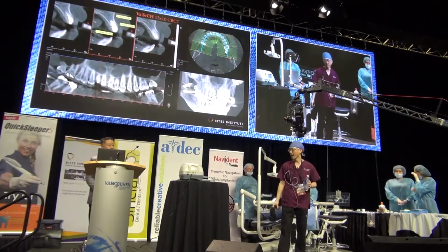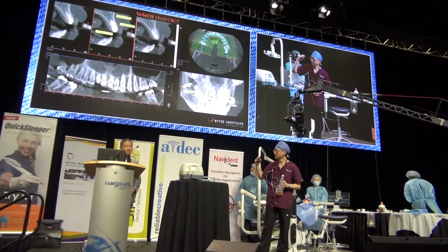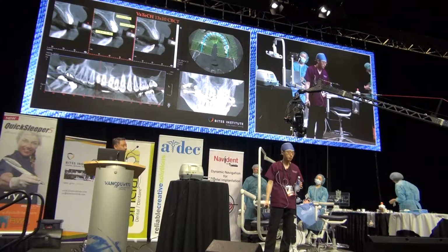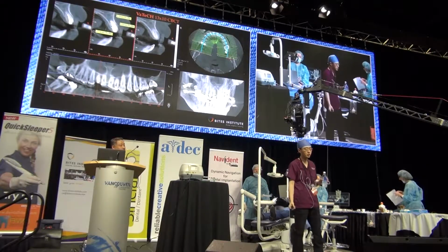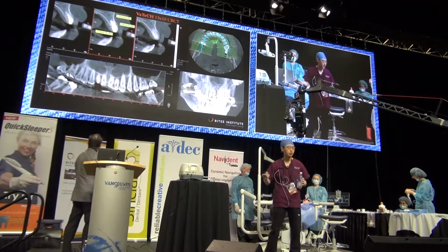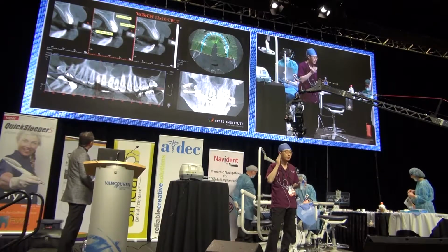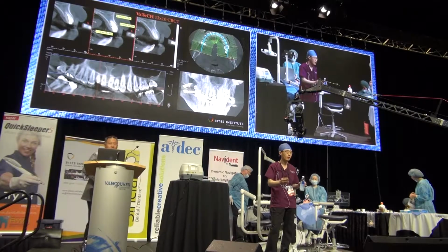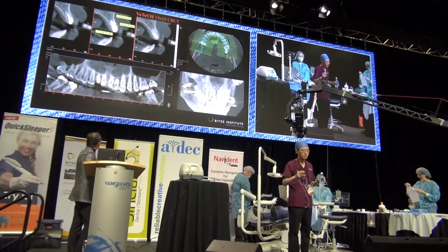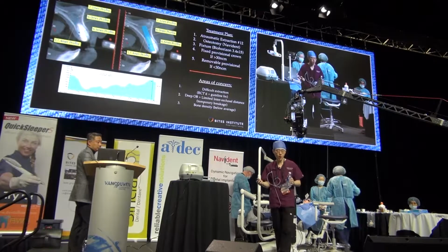Next, CT scan, absolutely important. Dr. Marklin, would you agree that now the CBCT is a standard of care? We're getting to the point, especially on immediate cases. Absolutely. What are we looking for in a cross-section of a CBCT? Several things. Bone volume, what the length of the root is, remaining bone. So by mapping this out, you have an idea at which angulation, what size, and what length of implant you're going to use. And also, it's not depicted here, but it will show on the next slide, the density of the bone.